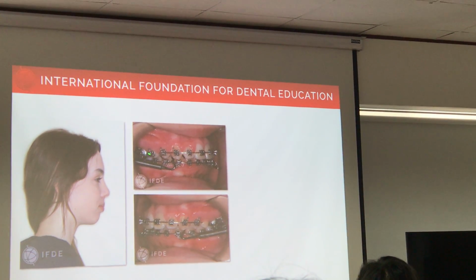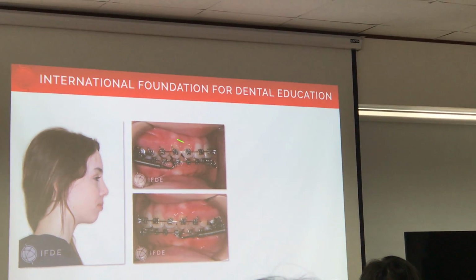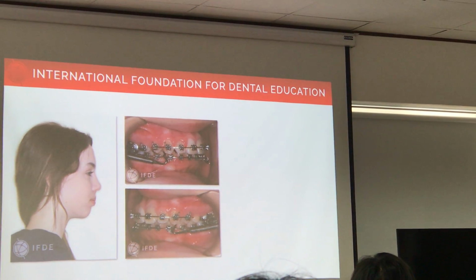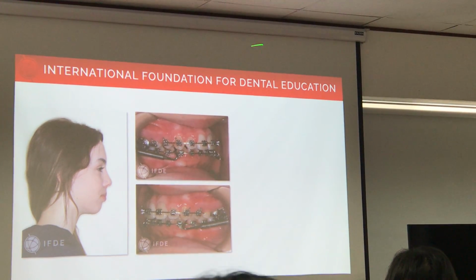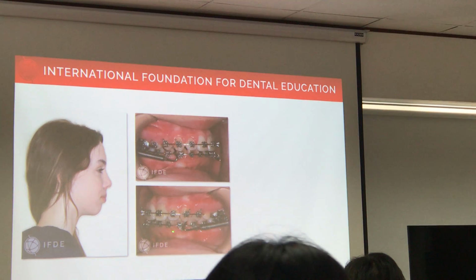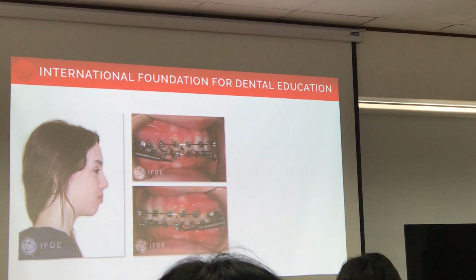so now all the force of the forces is actually to distalize and tip back the molar a little bit and let the occlusion settle by itself. I'm not doing it physically, I'm letting more, and she only lost the bracket there and even replace it. And I put the forces from the distal, not from the mesial, so I can pull the tooth as straight as I can.